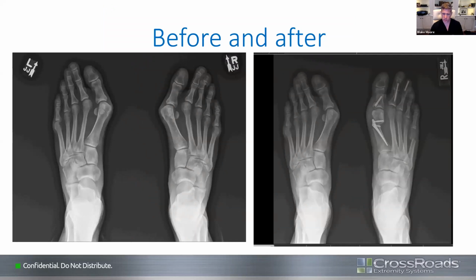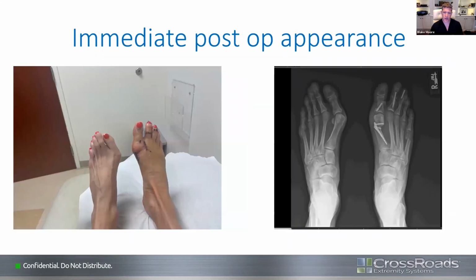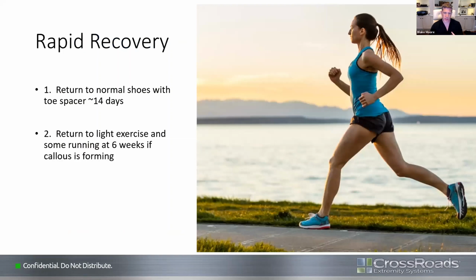So you can see the pretty significant correction in the overall alignment without a lot of shortening of the first ray, which sometimes is a little worrisome, especially in a runner. If you shorten the hallux, her getting a stress fracture of the second can sometimes be a concern. So if we show the next slide, this is the immediate post-op appearance of the foot and the significant improvement of the alignment of the MTP joint. You can see the additional incision for the Aiken osteotomy and the lateral capsular release and modified McBride. But yes, this is a great experience for her.